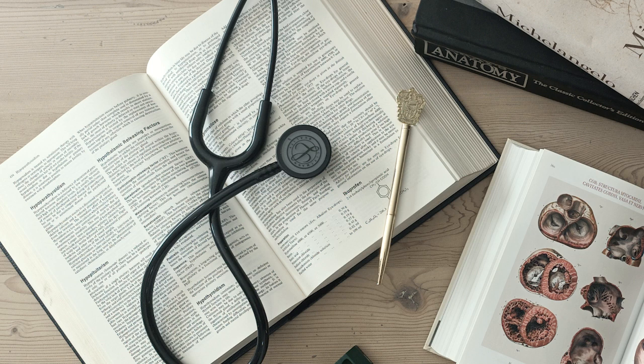And the second type, which is probably what most people picture when they think of a VPC, the one that really looks abnormal and wide. That's the early and markedly abnormal QRS complex, which is indeed the most common appearance for VPCs. On the ECG, you'll see a very large, bizarre, abnormal QRS complex that occurs prematurely. It's typically very wide, indicating slow conduction, and its axis is often wildly in the wrong direction, looking completely different from the normal QRS complexes. Again, there is no preceding early P wave.